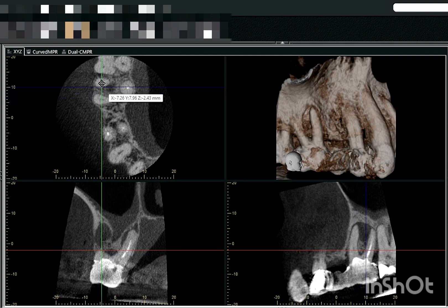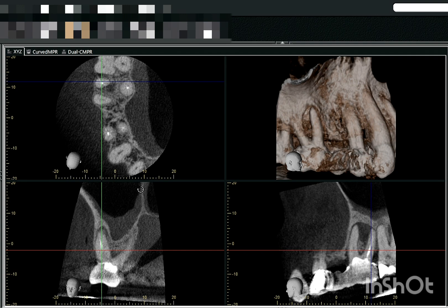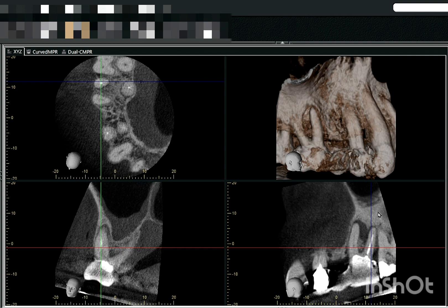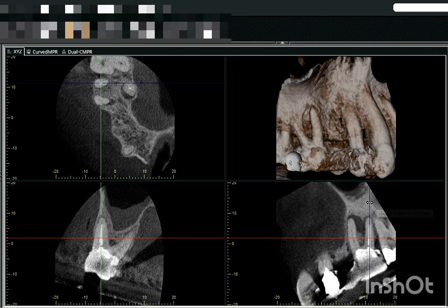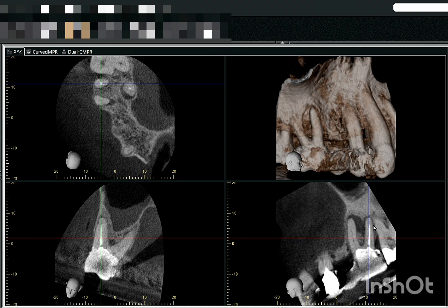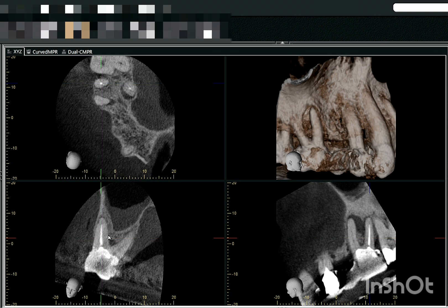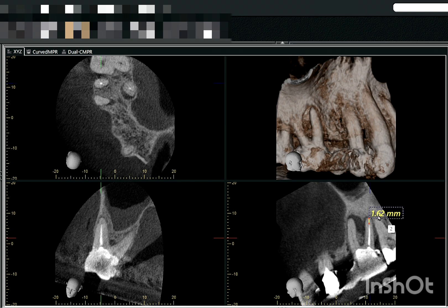You'll see the distobuccal canal over here. We'll arrange the lines along the long axis of the tooth. You can see this is the distobuccal canal, which is kind of underfilled or short of apex. PDL widening is noted, and this distobuccal canal is short of apex — approximately 1.5 mm short, as seen in both the coronal and sagittal sections.